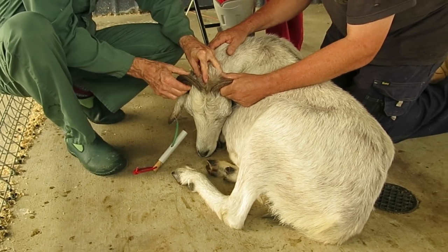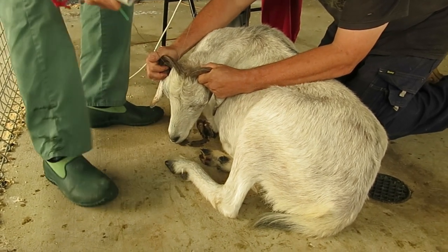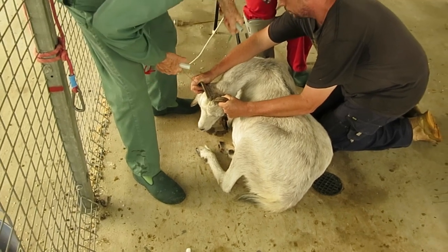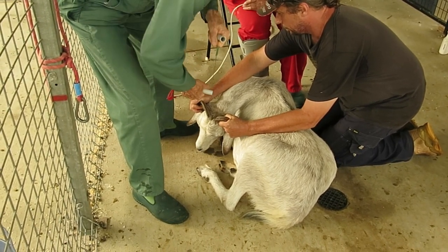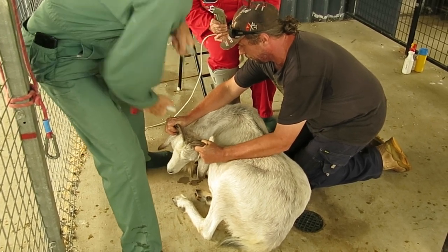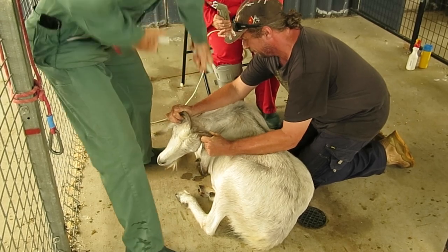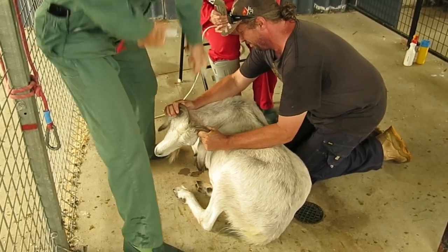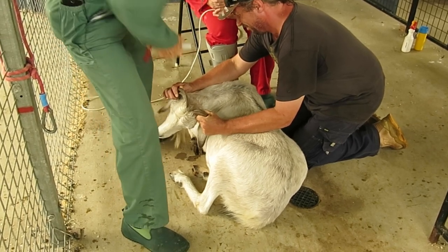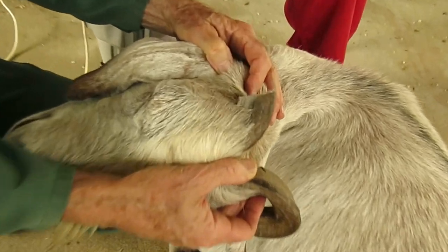The embryotomy wire is placed at a position where we think there will be no blood vessels. The embryotomy wire both cuts and to some extent cauterizes the horn tissue. It takes a lot of effort to cut through that horn, leaving some sharp edges that could be cut off with a file.